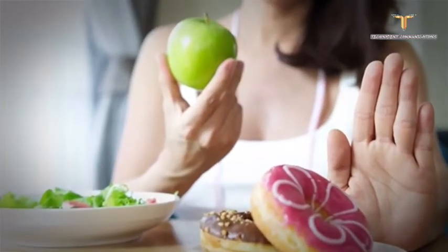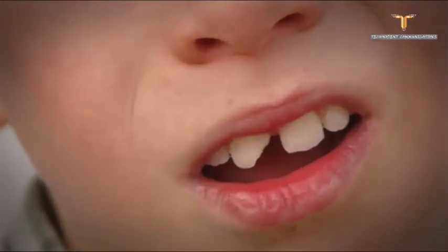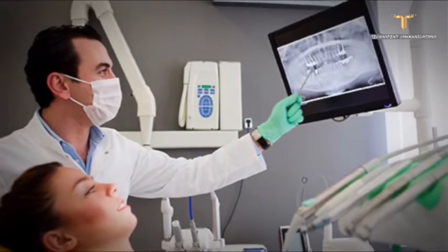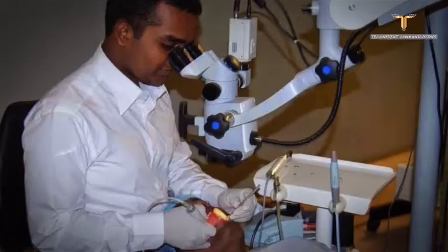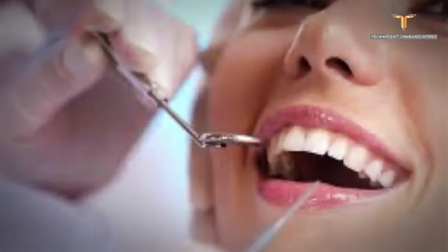Our lifestyle, eating habits, and injuries threaten our teeth and can ruin smiles. The latest advancements in treatment using state-of-the-art technologies like microscopes, dental lasers, and digital imaging can save many teeth and restore your smile.